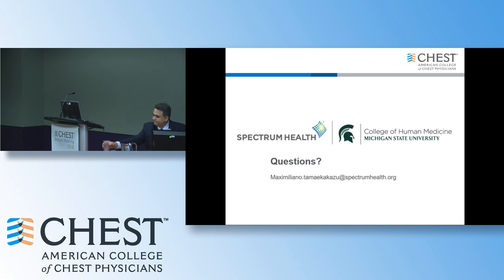Any other question? Yes. The transpulmonary driving pressure has been used for prognosis and it has been shown to be a better estimate in patients who have increased elastance. But otherwise, using the usual driving pressure and looking at the baseline, and after you make the changes in the PEEP, that should be good enough.